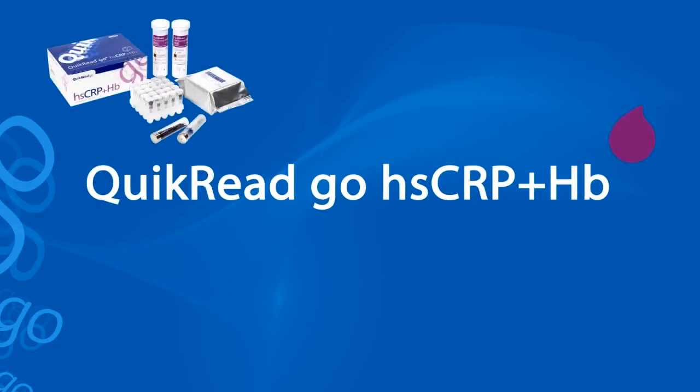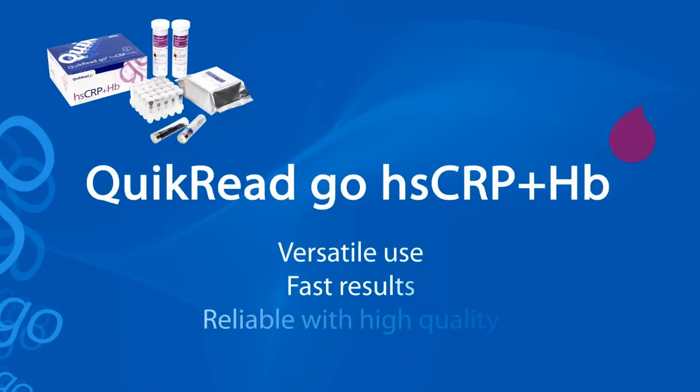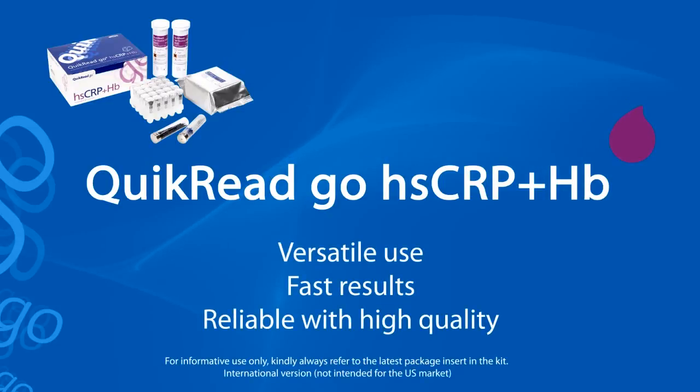Quick Read Go HSCRP plus HB test measures low CRP concentrations and hemoglobin. The ready-for-use test system enables fast results in urgent situations. The test is reliable with high quality, as the results are comparable to laboratory systems.